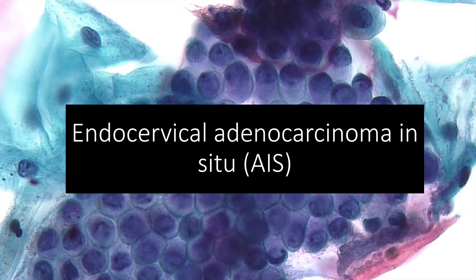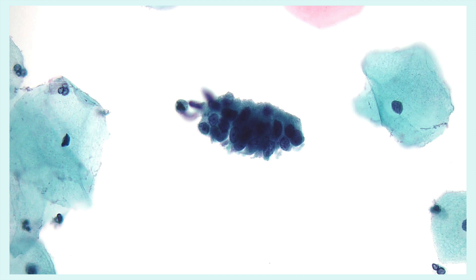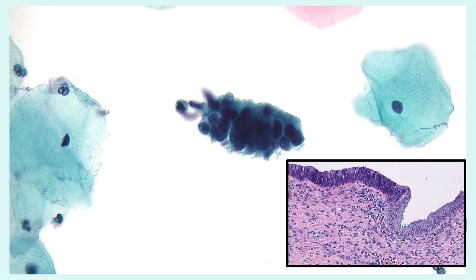Now we'll cover endocervical adenocarcinoma in situ, or AIS. Cells can be present in sheets and clusters and can have pseudostratification. Feathering is typical. Nuclei are enlarged, chromatin is coarse, and the nuclear-to-cytoplasmic ratio is elevated. Usually there's a clean background. This diagnosis should be made with caution if most of the above features are not present. This patient had abundant groups and coexisting high-grade squamous intraepithelial lesion, and follow-up showed adenocarcinoma in situ.